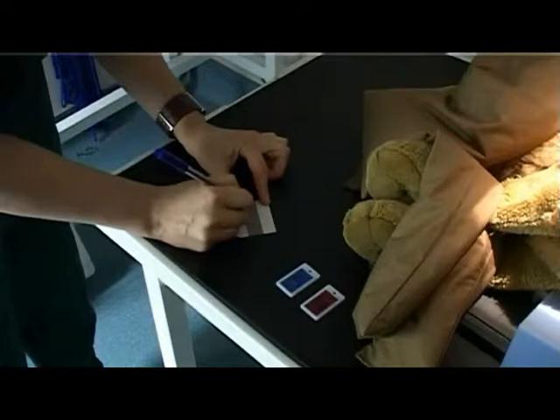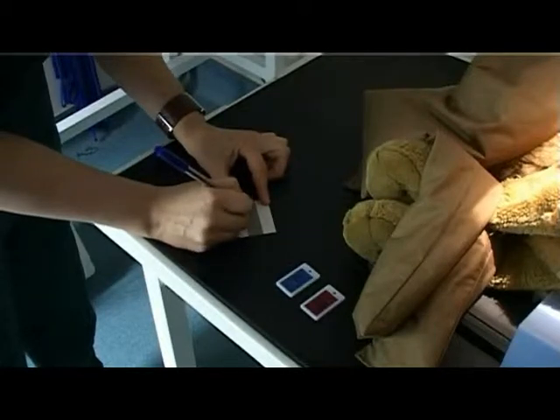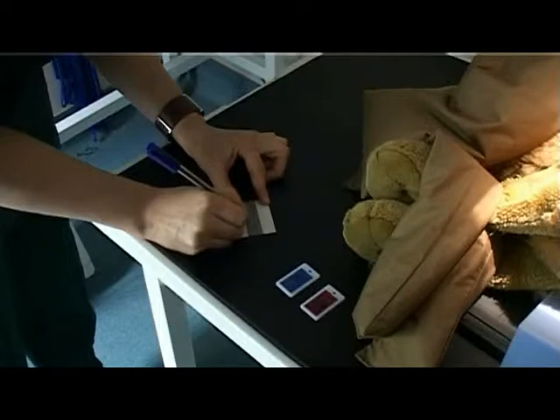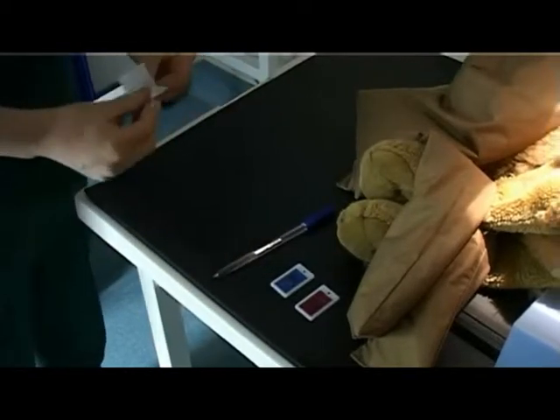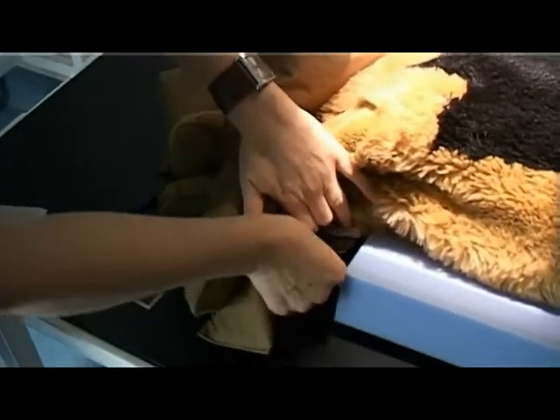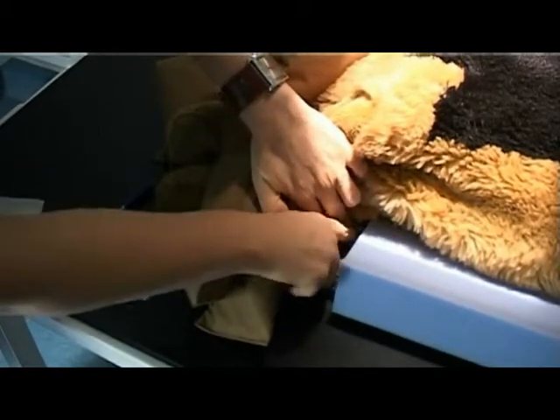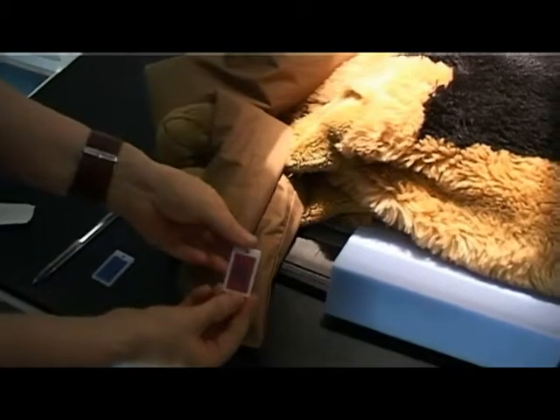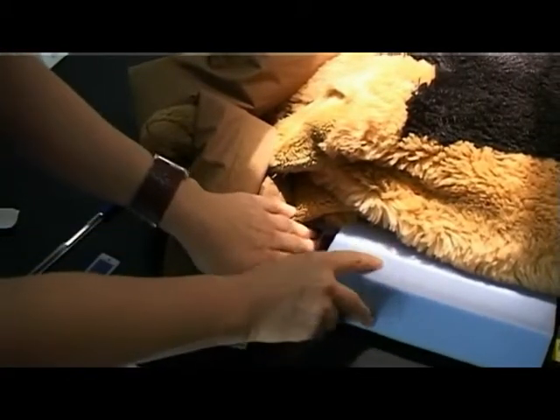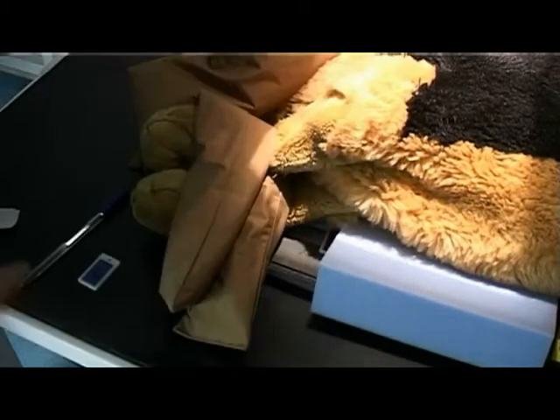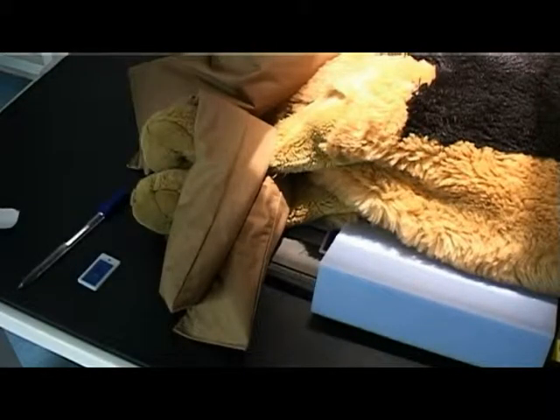Label the patient identification and date and place within the primary beam. Place the right marker also within the primary beam. You have now correctly positioned the patient for a right lateral radiograph of the thorax, including all the necessary equipment.